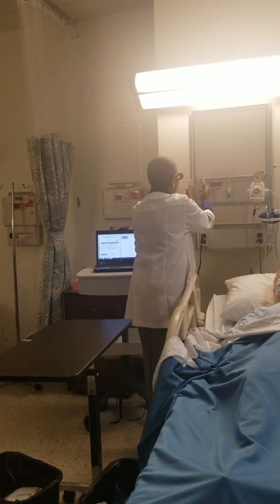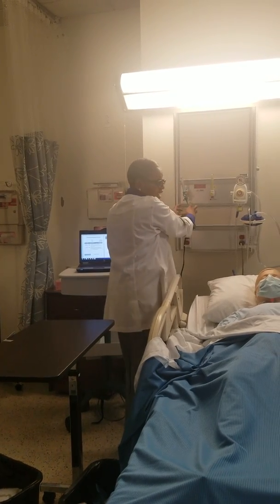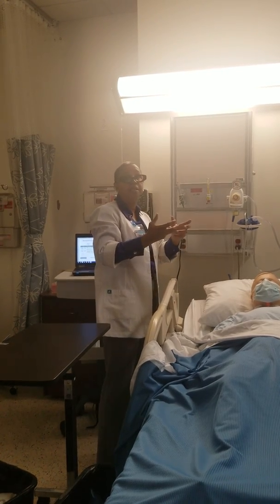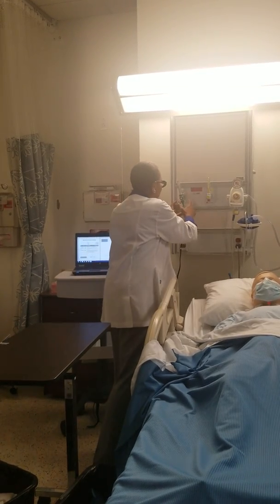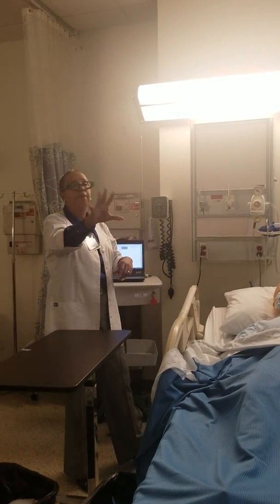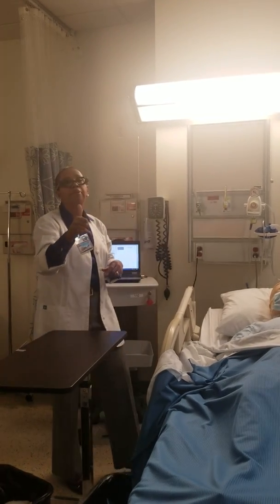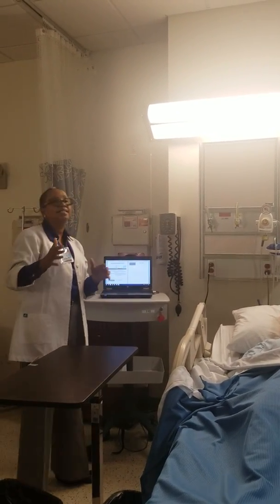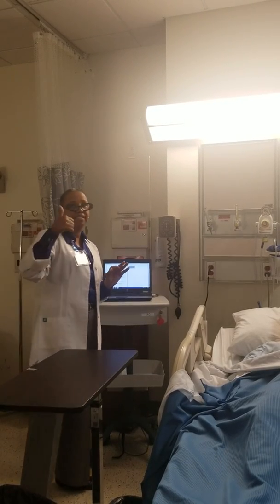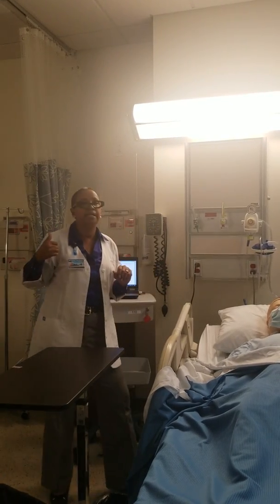When I'm here in the superior vena cava, everything's flowing. I'm just right in here. I have no movement. Once I move down here, I'm dealing with the atrium, and what happens with the atrium? It contracts. Right, absolutely. So when I get into the atrium, that thing is like this. It's contracting, so it's really irritating the atrium. It will throw your patient right into AFib, and then throw you a big old clot. That's why he's got to get out of there. He's got to get up into his superior vena cava, and he can rest there.